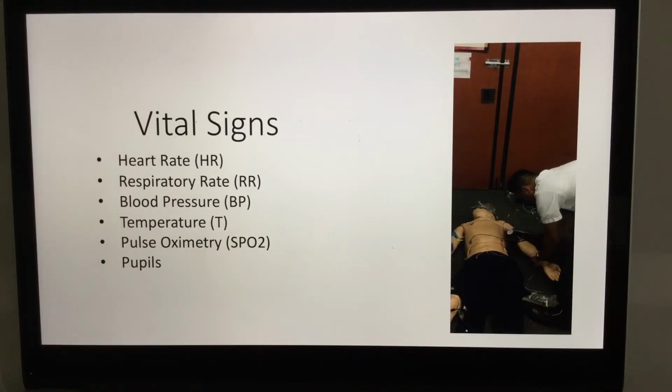So we're going to do it very slowly, and we're going to start listening for the sound as soon as we start to deflate. So you need to move your thumb off of that pulse point and put your stethoscope right on there. Ensure that those earpieces are in. Release the pressure valve and slowly deflate the cuff and listen for the first sound. That first sound is the systolic number.